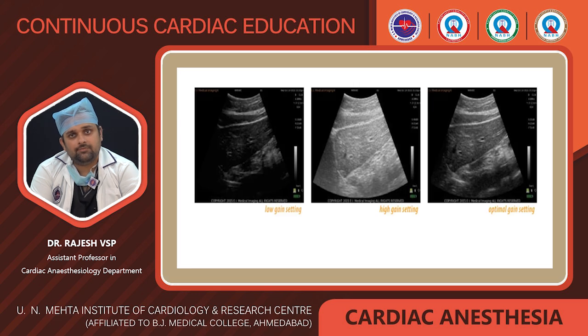These are the different ultrasound images, showing where the gain setting is low on the far left, coming to the high gain setting in the middle one, and the optimal gain setting where you can differentiate the different structures in the right slide.